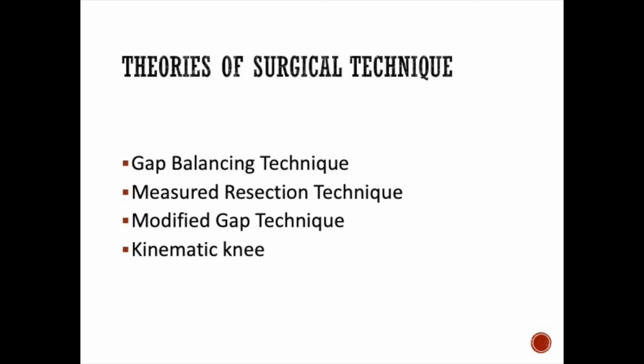So now that we're through the approach and we're ready to begin the case, now we talk about our different cutting techniques. There are several different theories of the surgical technique. There's the gap balancing technique, the measured resection technique, the modified gap technique, and then the kinematic knee.